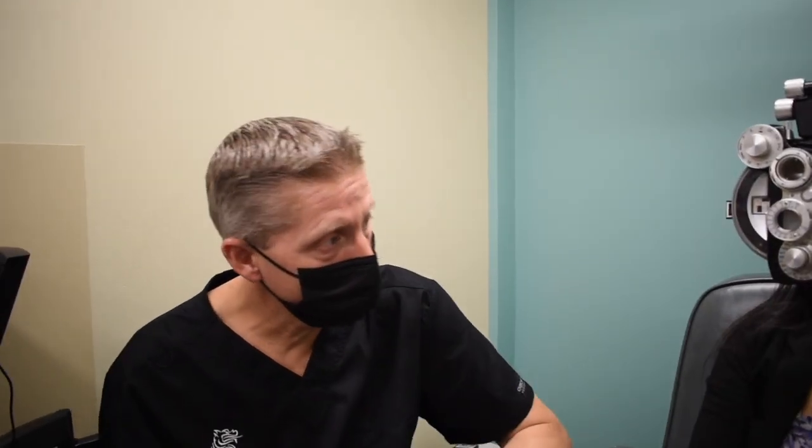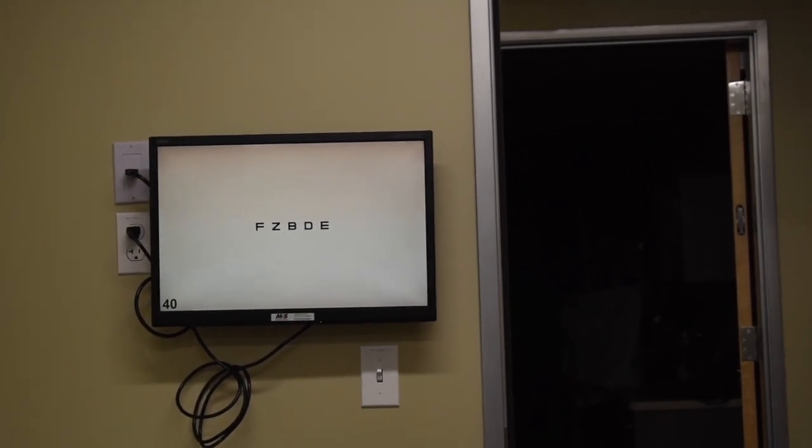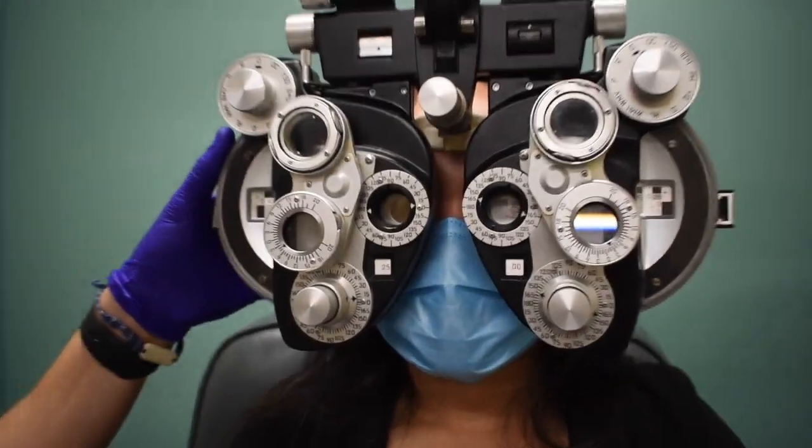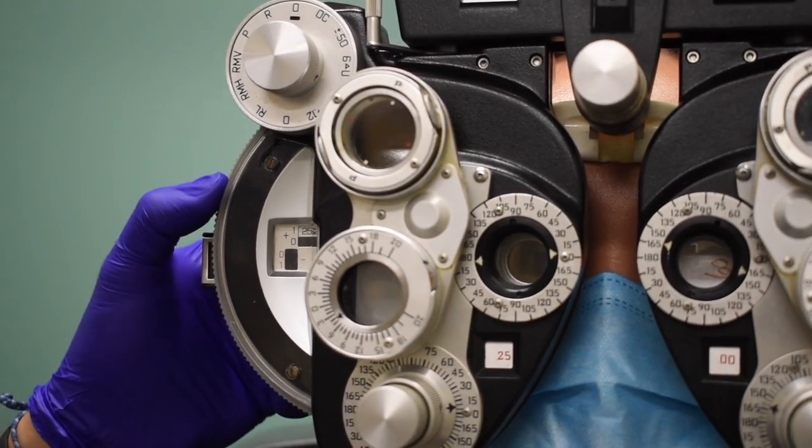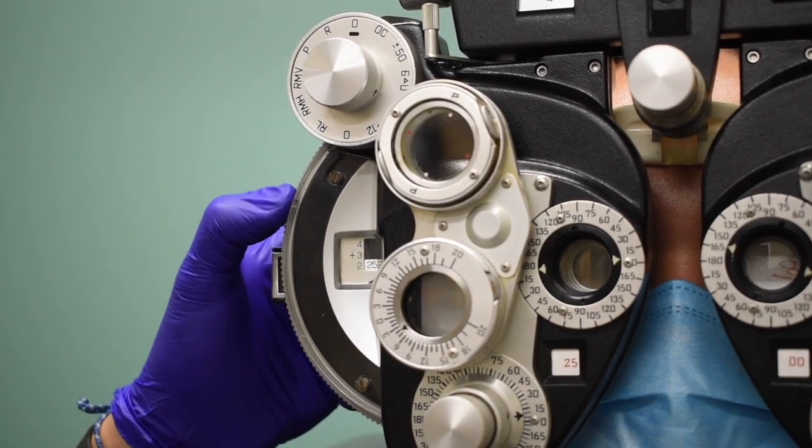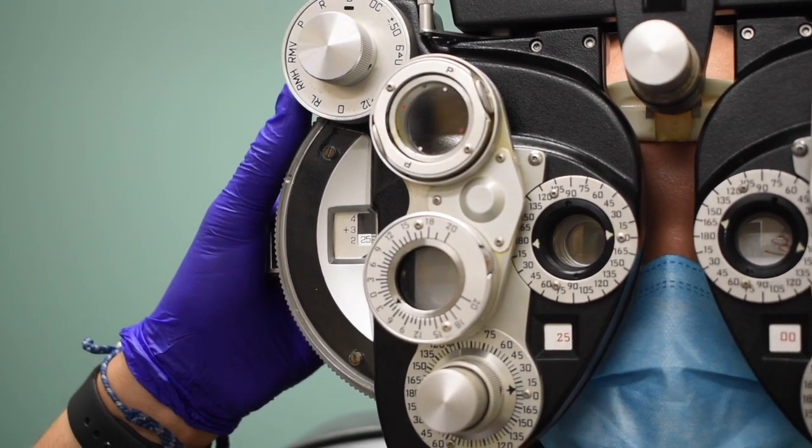So we've already read our patient, we're going to 2040 blur. All right, so Phoebe as you're looking over there, can you make out those letters? Yes. Awesome. We've got one eye closed, one eye open. Please tell me when those letters are so blurry you can't make any of them out at all. Right here. Good.